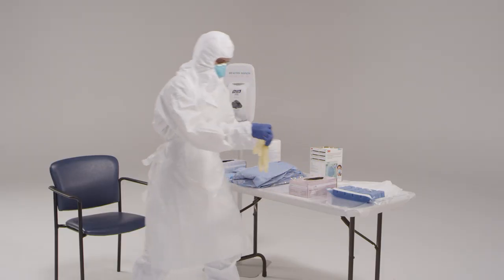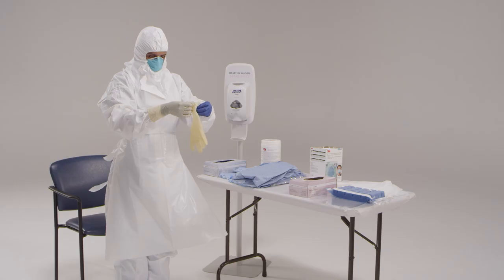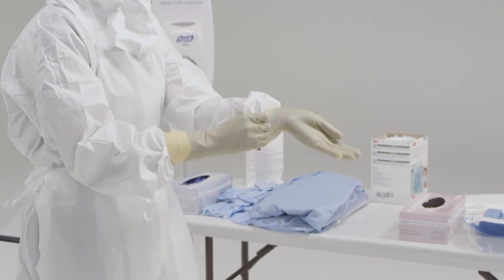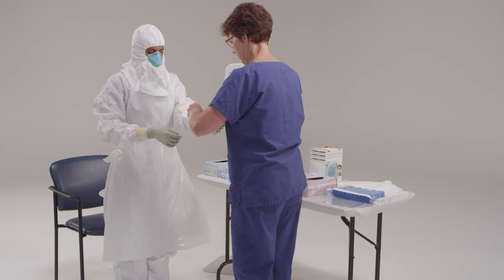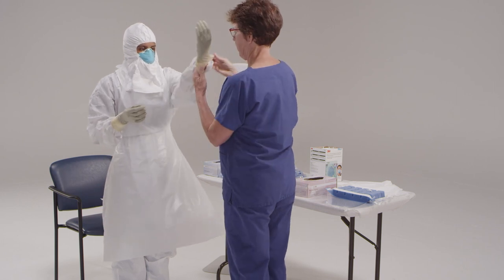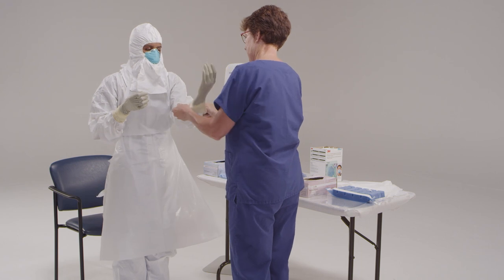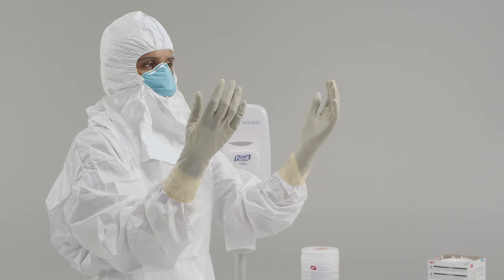Now it's time to put on your outer gloves. It may be necessary to ask your trained observer for assistance when putting on the outer gloves. Double-gloving provides an extra layer of safety during direct patient care and during the personal protective equipment removal process. Some facilities have found that using different colored gloves for the outer gloves is beneficial, as it helps to rapidly identify any breaches in glove integrity.